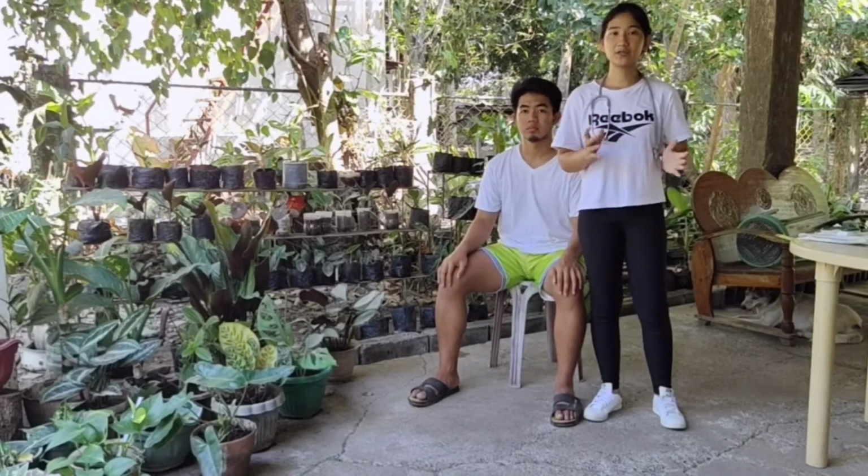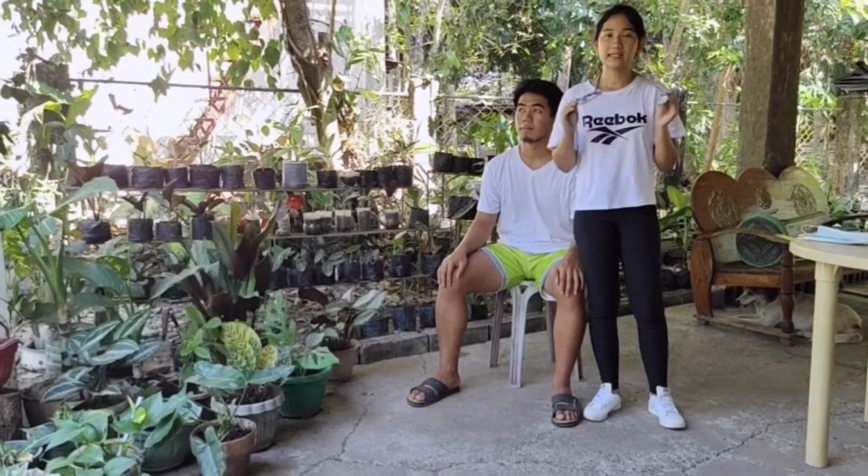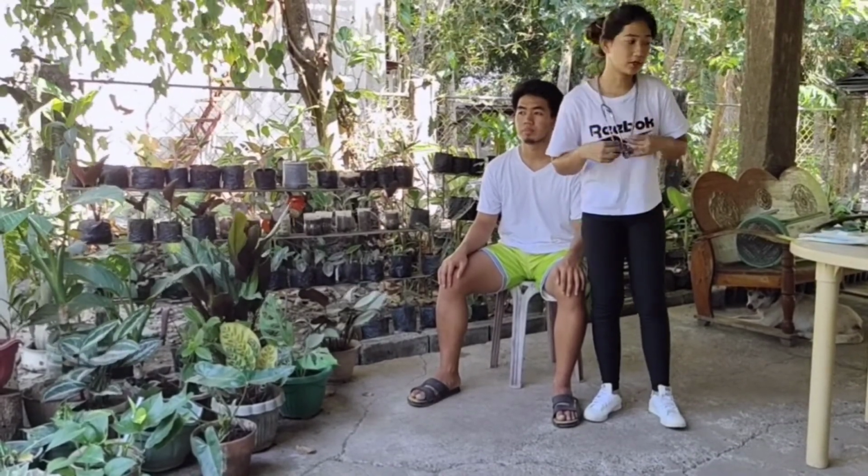Good day to everyone. I am Nicole Angelou Serrano Aranda, and today I'm going to demonstrate to you how to assess the thorax and the lungs. So first is to assemble our equipment before preparing our client. The first thing that you should have is our stethoscope. Stethoscope is used for auscultation.